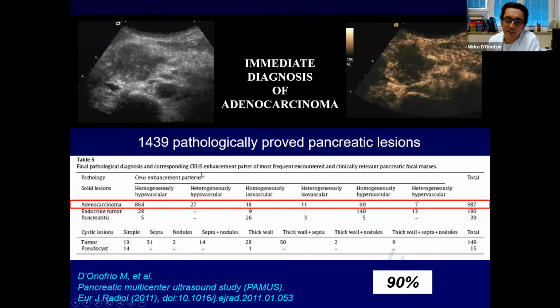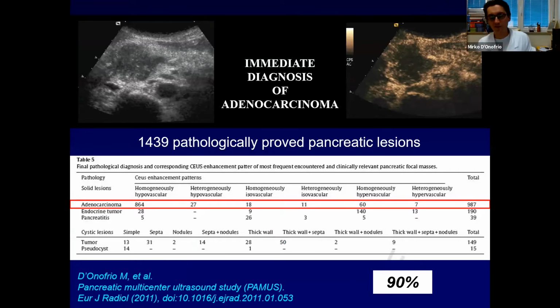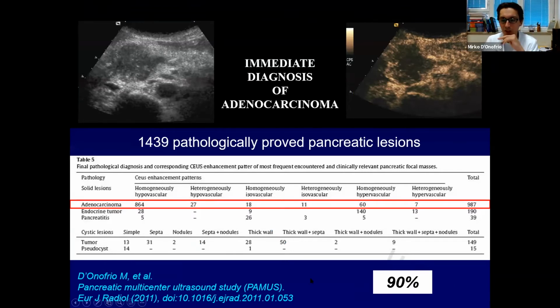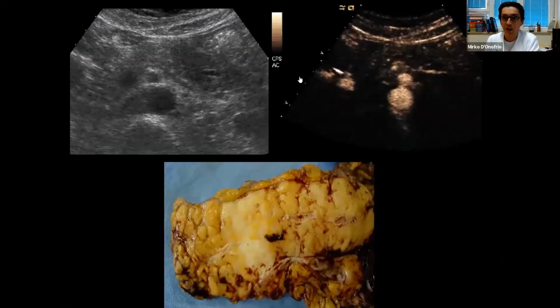This is a multi-center study with a pathological confirmation of the lesion. And once again, ductal adenocarcinoma was hypovascular in 90%. So an immediate diagnosis of this lesion is possible during the same ultrasound examination.